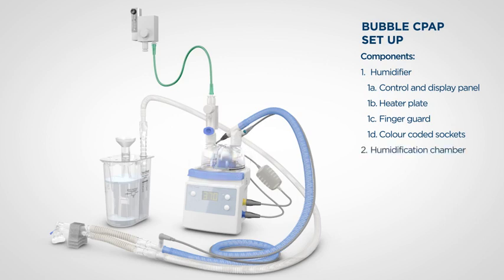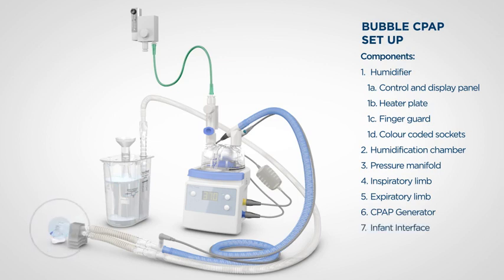This is the humidification chamber that holds water. It is filled from a rigid or flexible water bag through the water feed tube. This is the pressure manifold, designed to limit the pressure to 17 centimetres of water at 8 litres per minute. This is the breathing circuit — it carries humidified gas to the patient and carries expired gas back to the CPAP generator. This is the CPAP generator, which maintains mean CPAP pressure. You can also see the oxygen blender and oxygen tubing used to complete the Bubble CPAP delivery system.